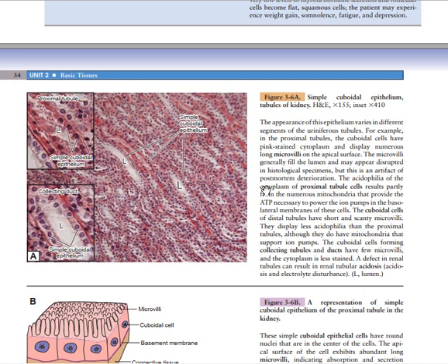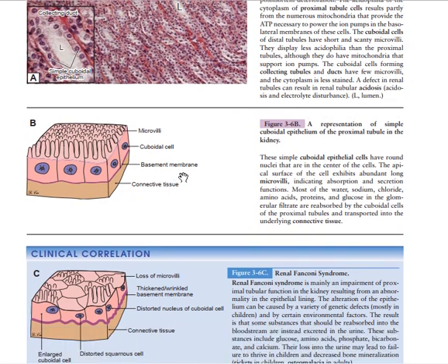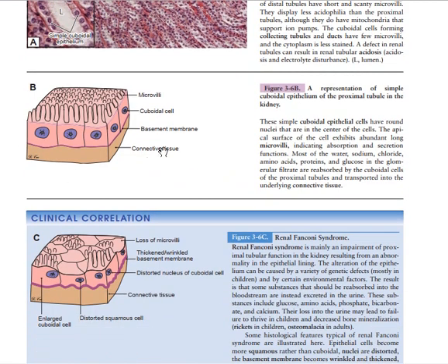If you go back to cytology, you see that the renal tubules have many mitochondria to produce ATP for the reabsorption of these materials. When they reabsorb these materials, they can be recirculated into the system. So this is just the visualization. You see that at the apical most part, you have many microvilli for the reabsorption, and then it's cuboidal cells. So when you have cuboidal cells plus microvilli, it can make you think of the renal tubule cell.